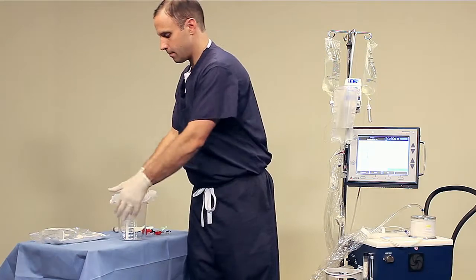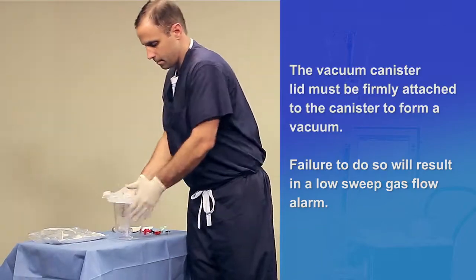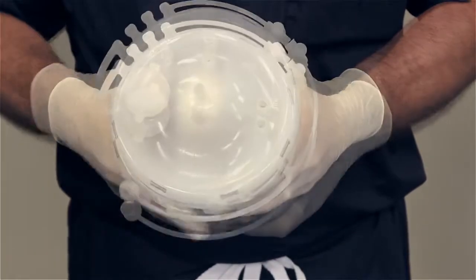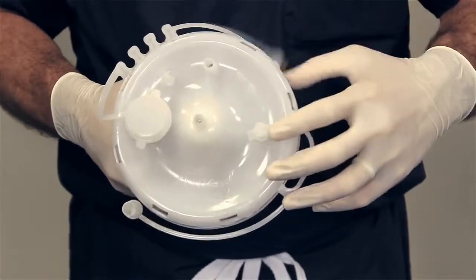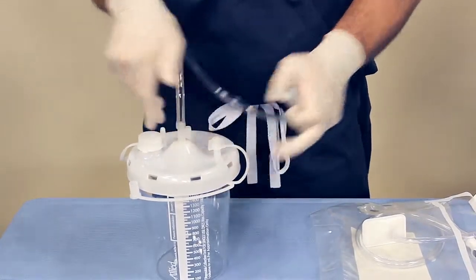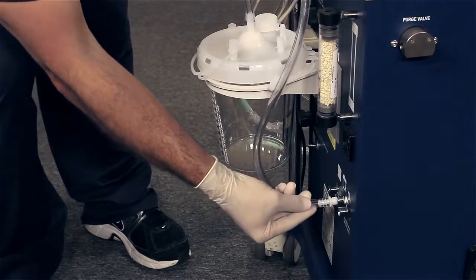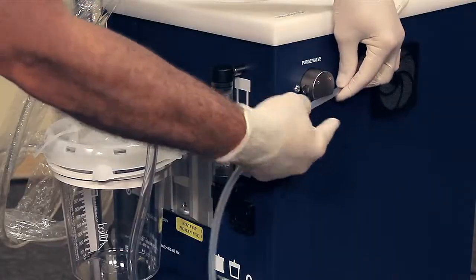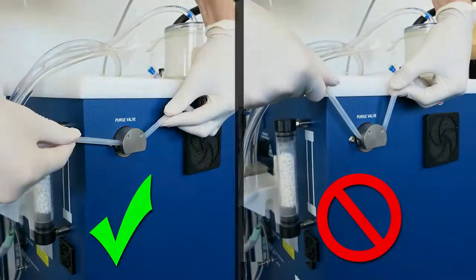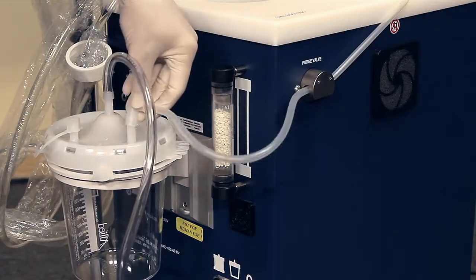Assemble a vacuum canister by firmly applying pressure around the circumference of the lid — several clicks will be heard when properly secured. Cap the two unused ports labeled accessory and tandem. Attach the sweep gas vacuum tube to the center port of the vacuum canister, then place the canister on the controller. Connect the sweep gas vacuum tube to the controller. Install the silicone sweep gas tube from the cartridge into the purge valve, then connect it to the vacuum canister port labeled patient.